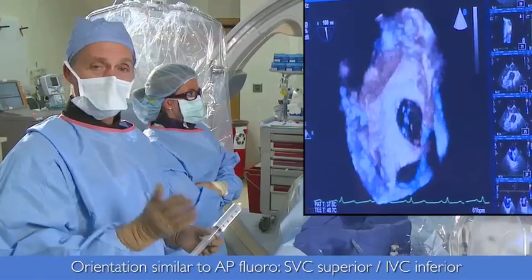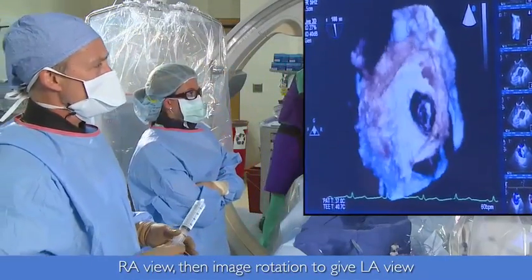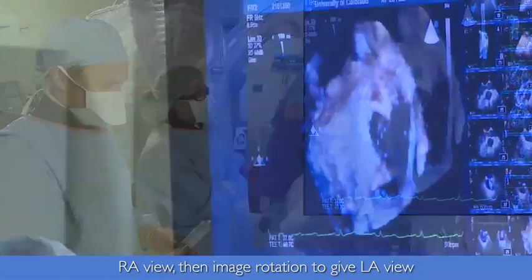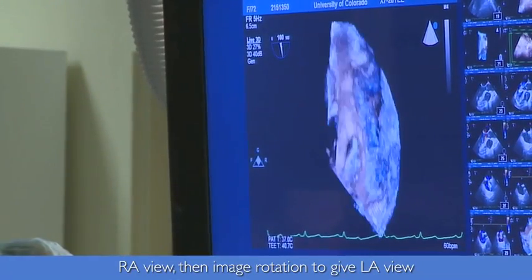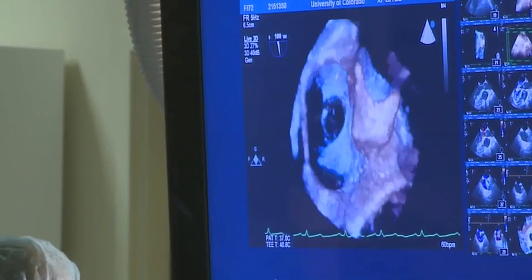So we're looking now on the right atrial side, and could you turn it around? Let's look at the left atrial side of the defect. So there it is from the left side.